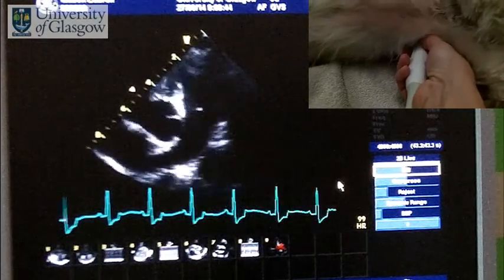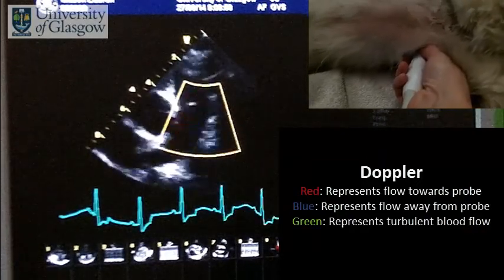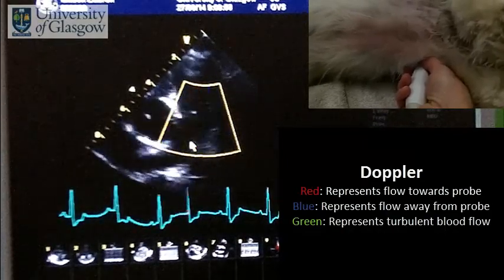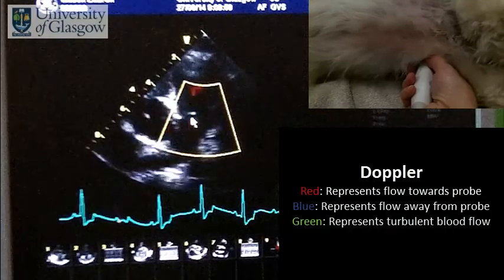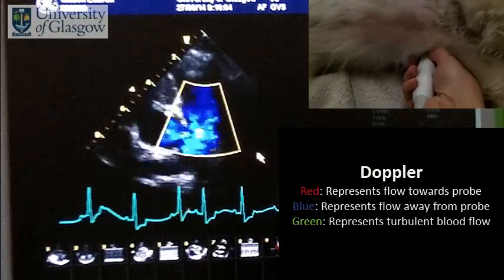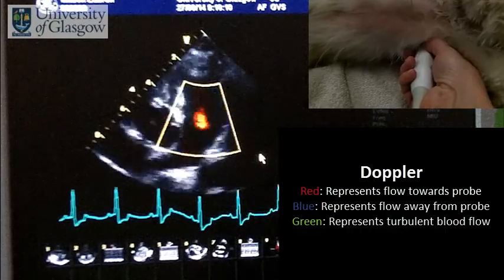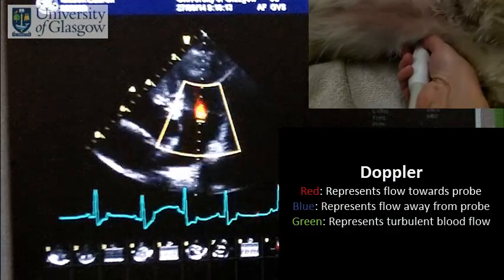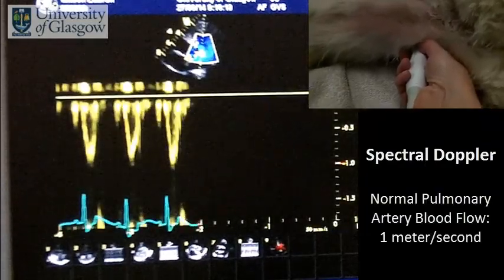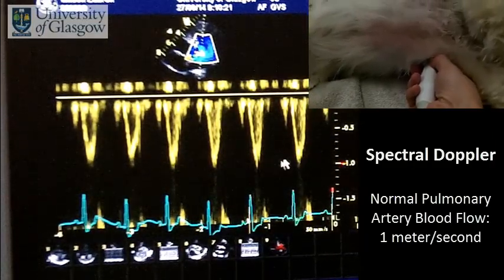We can look at the morphology and use color to check for abnormal flow. We can see the nice blue laminar flow in the pulmonary artery, and a little small red flow going backwards — a small insufficiency jet across the pulmonic valve. We can also check the spectral Doppler for the speed of blood flow in the pulmonary artery, which is going about one meter per second, which is absolutely normal.